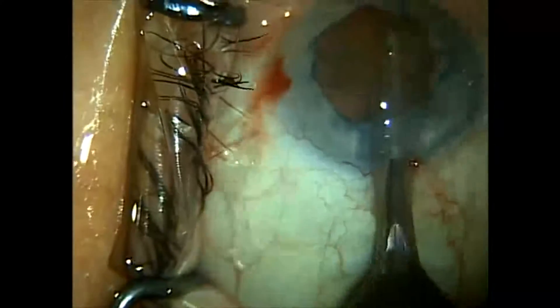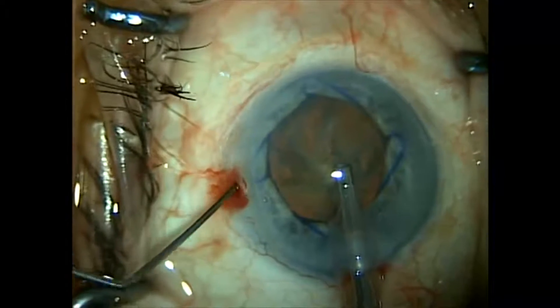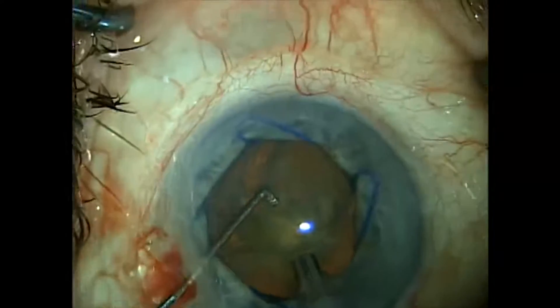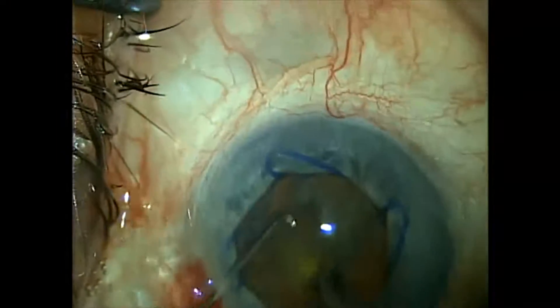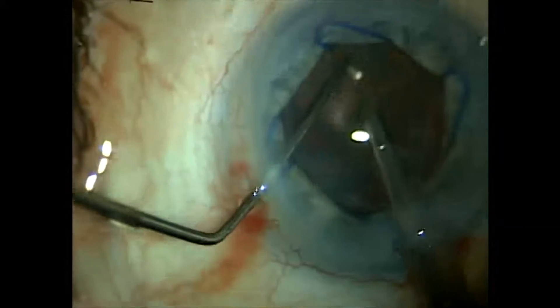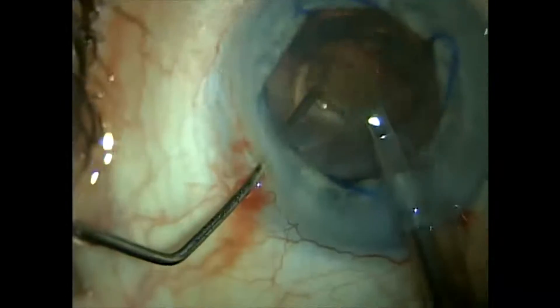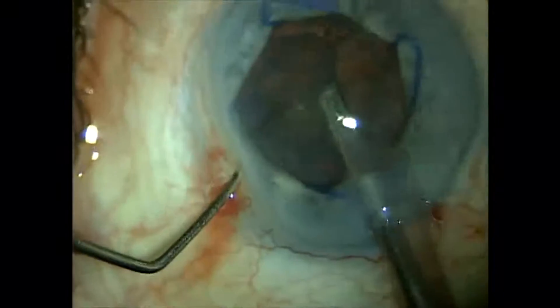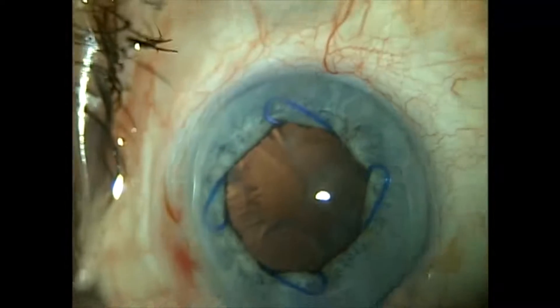We use an AMO Signature phacoemulsification system. Our phaco handpiece is the Ellips FX handpiece, which is very good at removing dense nuclei. In the interest of time I don't show all the phacoemulsification. Here we've removed the nucleus.